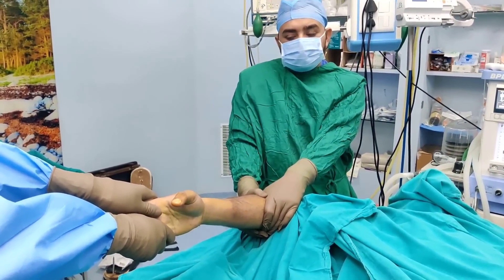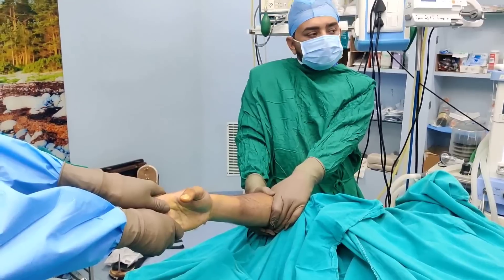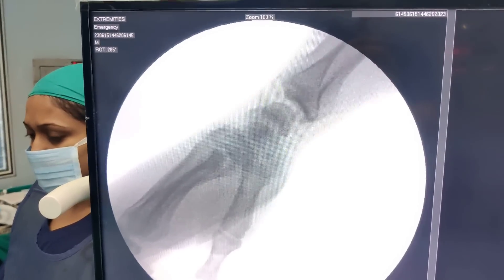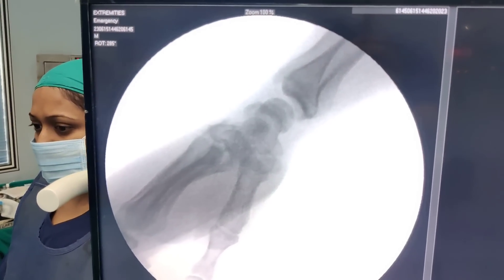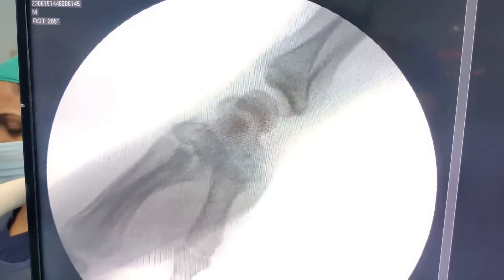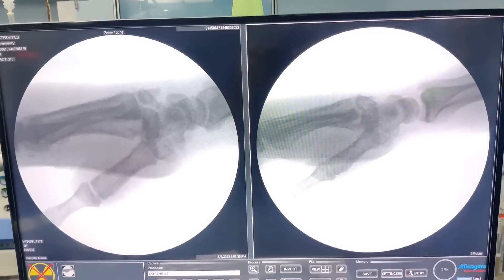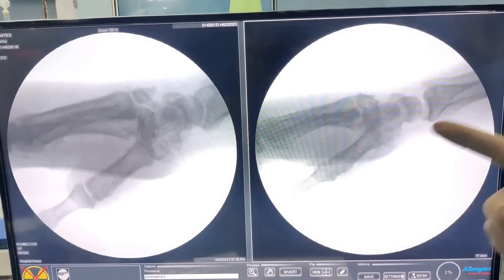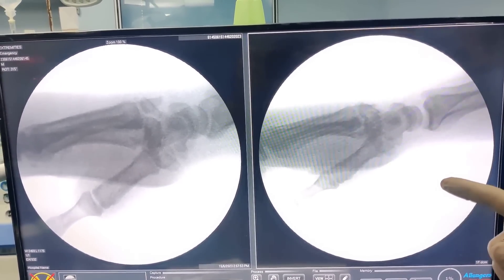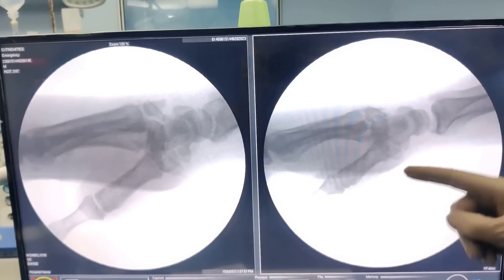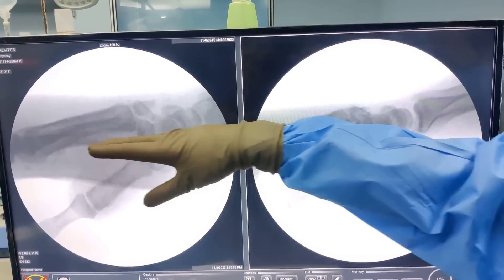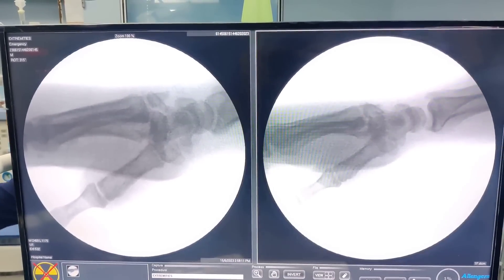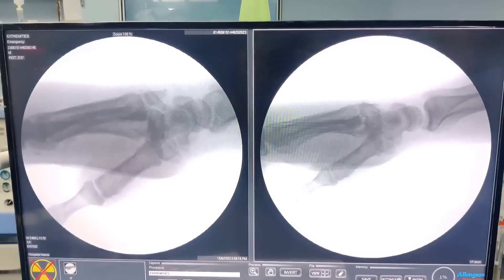We have been applying traction for 2–3 minutes now, and if you see the X-ray on screen you will see it is nicely reduced. However, as soon as I release the traction it subluxes again, suggesting it is quite unstable. The image on the right is with traction on; the image on the left is with traction released. It is not always like this — most times the joint sits down and all it needs is a K-wire. But in this case the dorsal support is gone: the metacarpals should be in a straight line but these two are jumping dorsally. So I am going to have two assistants maintain traction while I fire the wire to keep it secured.